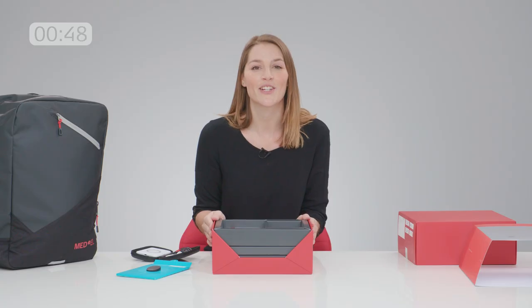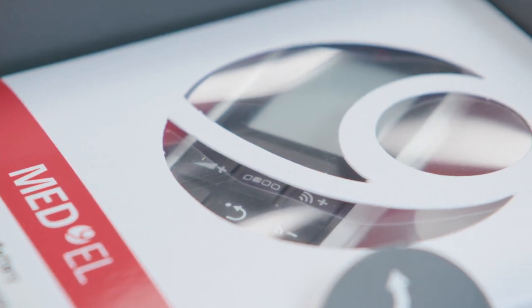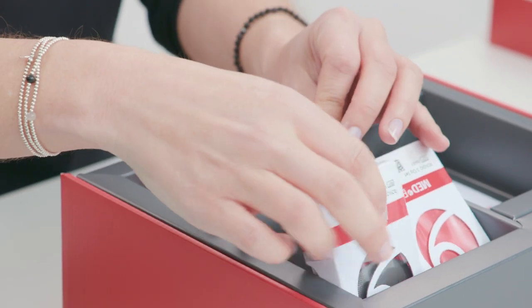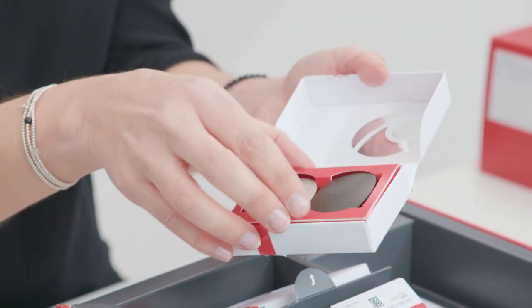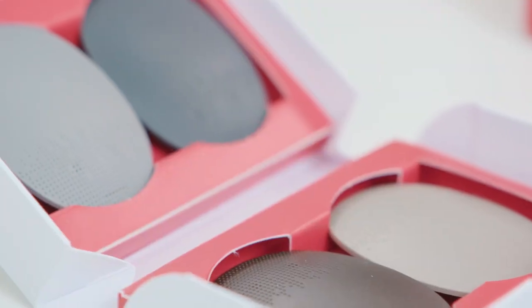Rondo 3 comes with a lot of accessories. You'll find the sleek Fine Tuner Echo remote control, three optional attachment clips, and four additional covers in different colors. To see all our 30-plus design covers, you can check out medel.com/Rondo3.